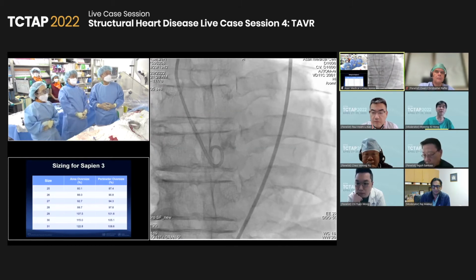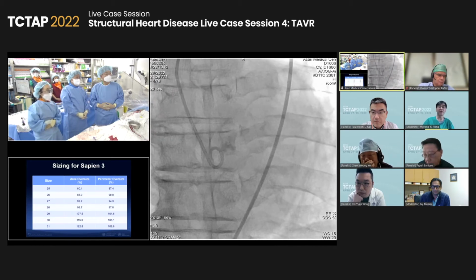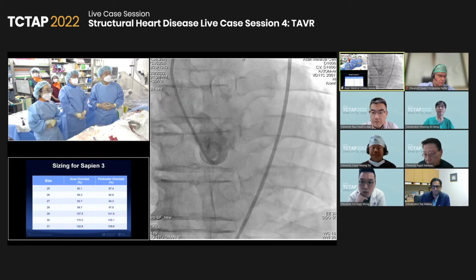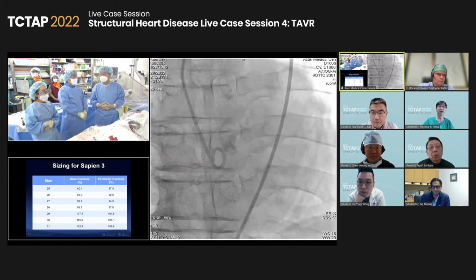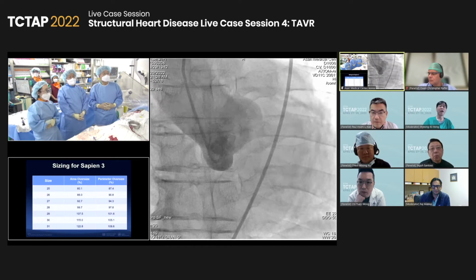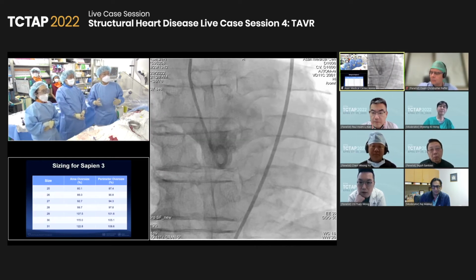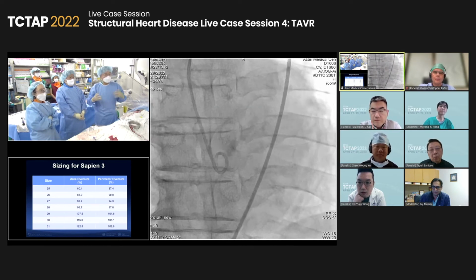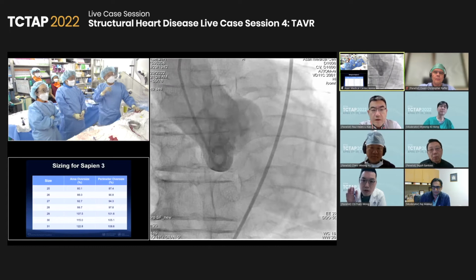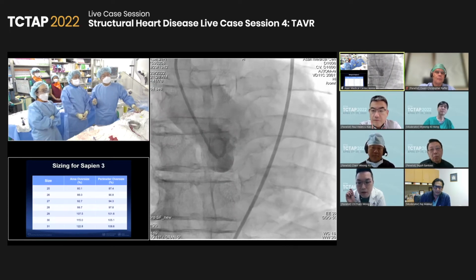It means there may be involvement of rheumatic disease in another valve, such as the mitral valve or others. Yeah, other valves are okay. All right. From an expertise point of view, any concern about the rheumatic origin of valve disruption rather than the degenerative ones?